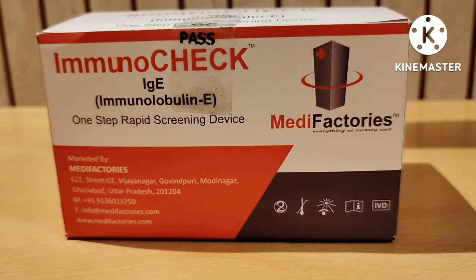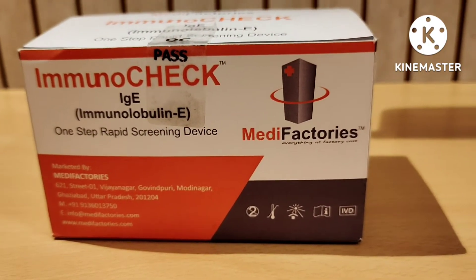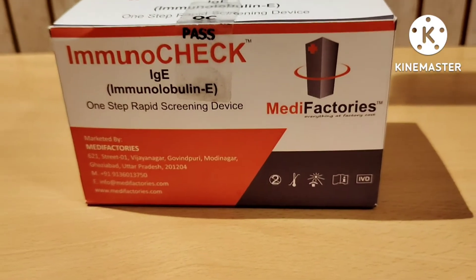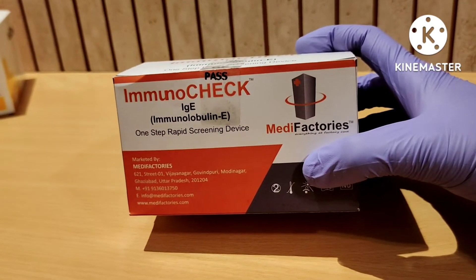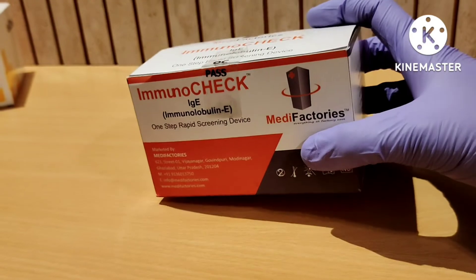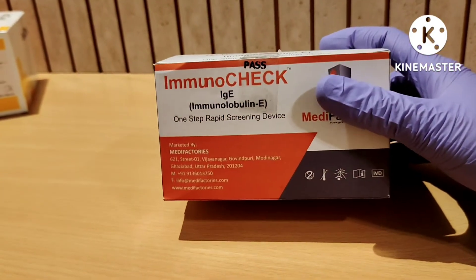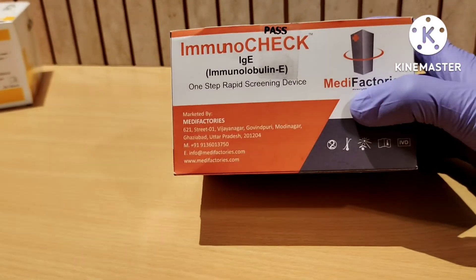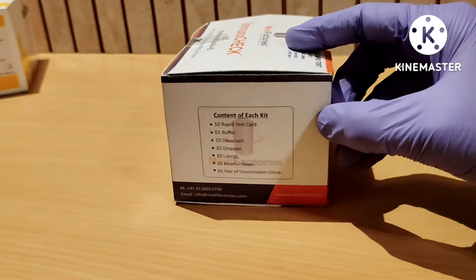Hello friends, today we are going to show you the test procedure for ImmunoCHECK IgE — Immunoglobulin E — one-step rapid screening device. This is the ImmunoCHECK rapid test kit which we use to detect the IgE amount in our blood. This test can be performed on whole blood, serum, and plasma. It is marketed by MediFactories.